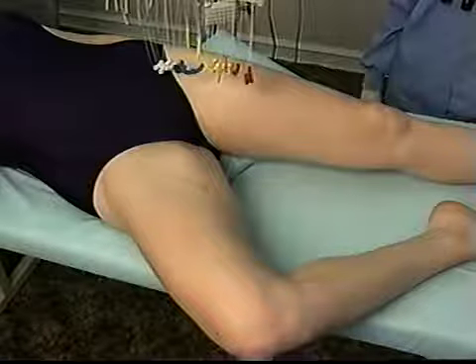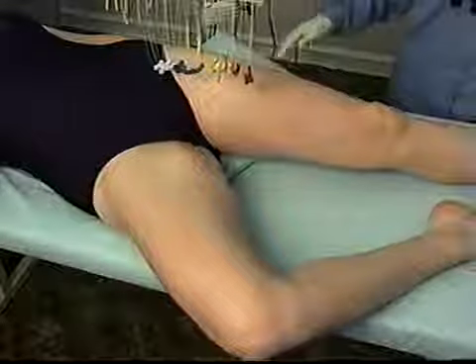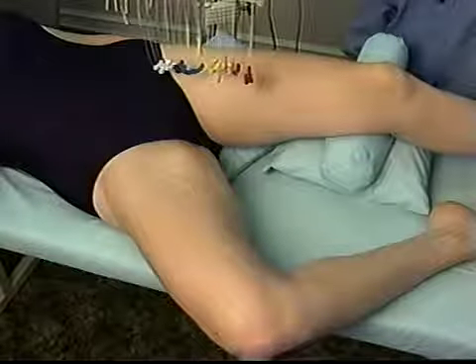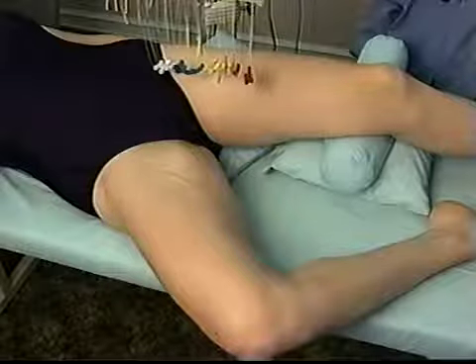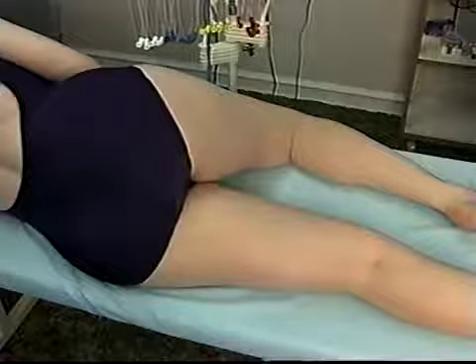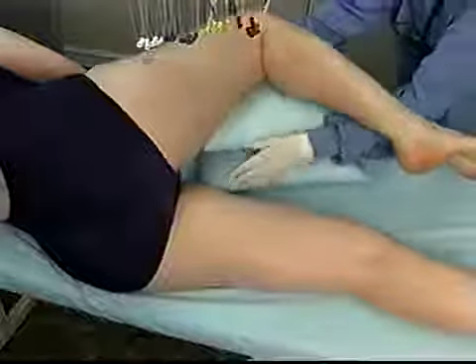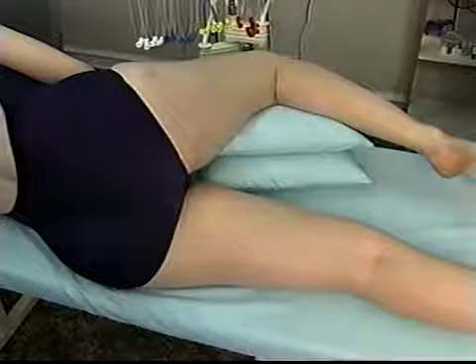As we progress toward the center, I tilt the patient by placing a pillow under her buttocks. Sometimes I place more pillows under her left knee. As we progress further toward the center, it is easier to reach if you reverse the patient. Have her lie on her side with her back towards you. Place the left leg straight and bend the right knee. Place 1 or 2 pillows under her right knee. This position will also accommodate the buttocks.